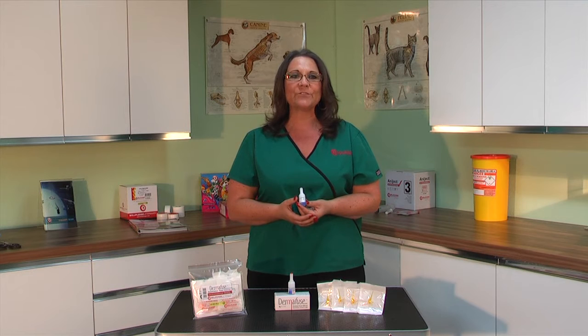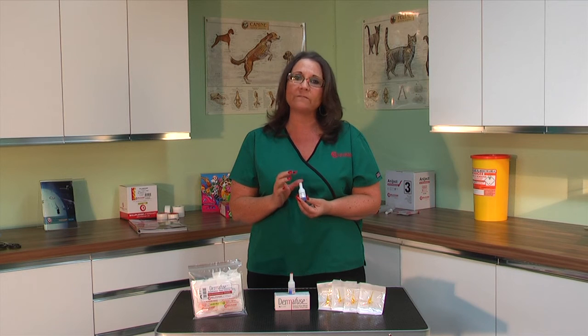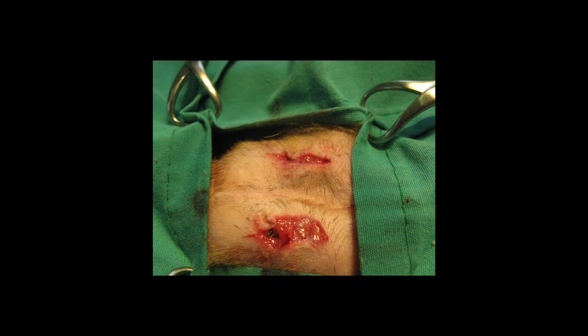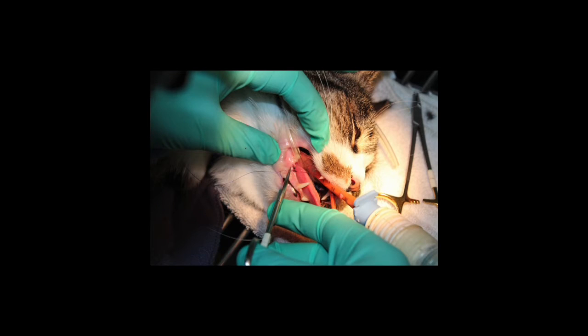Hello, I'm going to show you a demonstration of how to use Dermafuse. Dermafuse is a medical grade embutyl cyanoacrylate adhesive and it can be used to bond tissue together following many veterinary procedures, for example lacerations, abrasions, gives extra security to sutures and staples, and is often used after tooth extractions and other oral surgery.